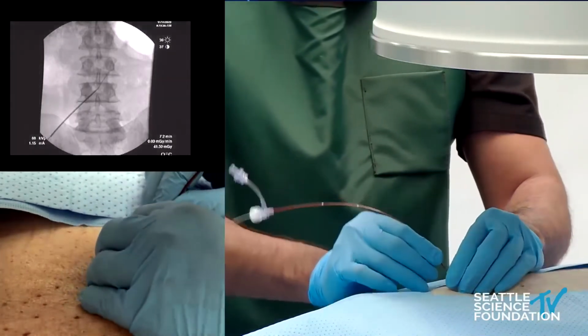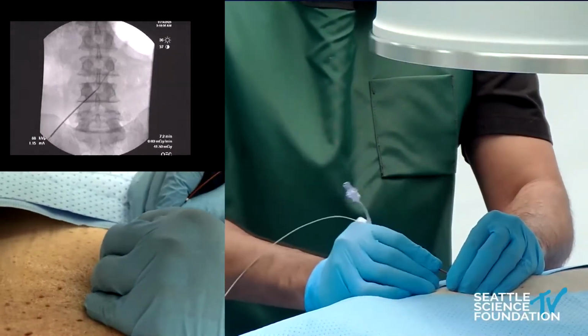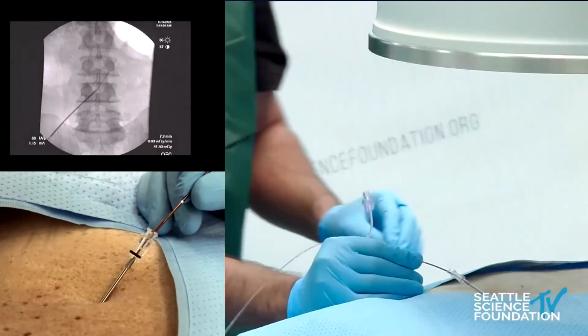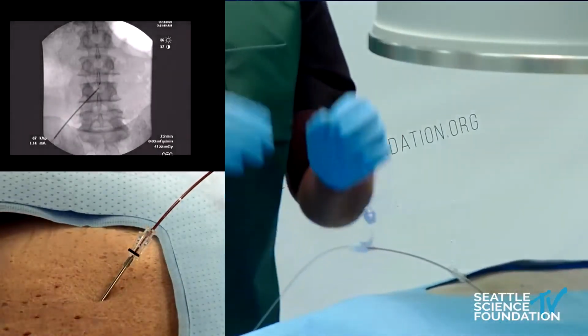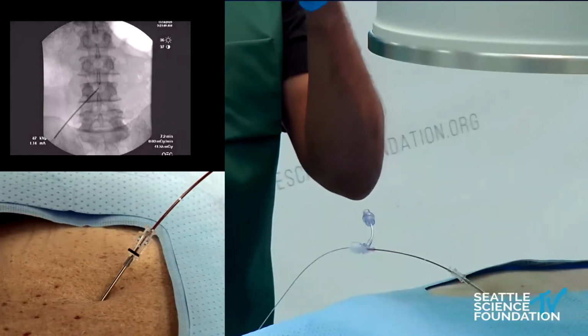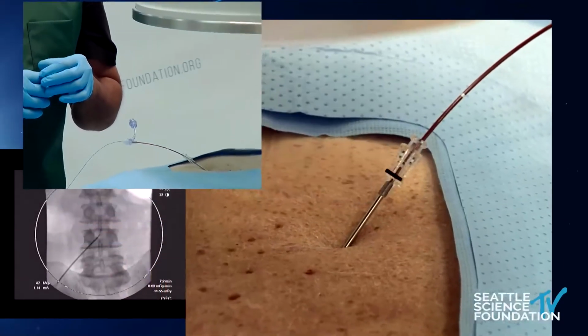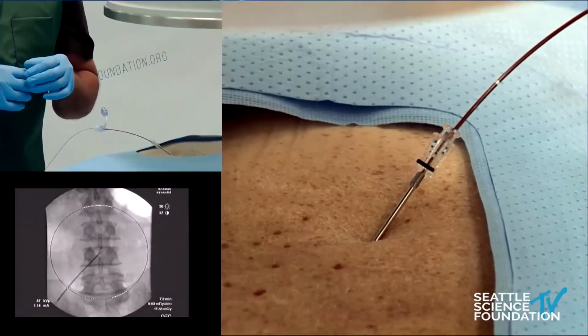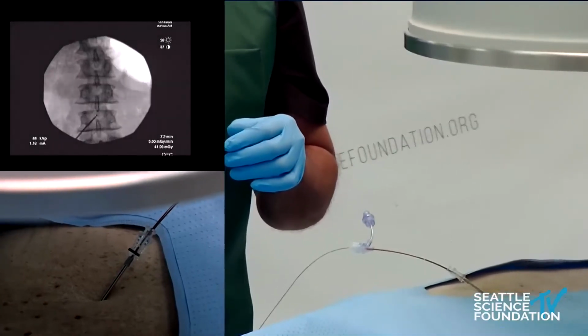So I'll just start out by inserting my sheath, and I'll watch to make sure that the white dot goes across. So now I know I'm in the epidural space. And Justin, if you could collimate circle over the right L3 pedicle, that would be ideal. And then sort of shift, yep, exactly, up and out towards you. And then I'll take a spot shot there.